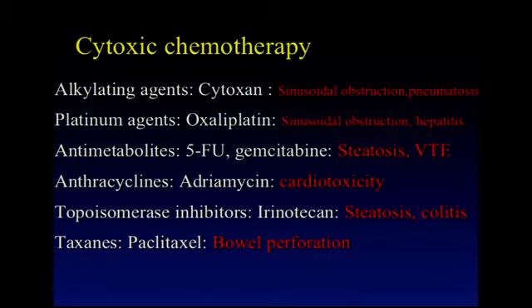So just a brief review of standard cytotoxic chemotherapy. The agents are shown on this image, and while they have been very useful in treating oncologic problems, they carry their own side effects, and some of them can be diagnosed with ultrasound, including sinusoidal obstruction syndrome, such as we see here, or steatosis.